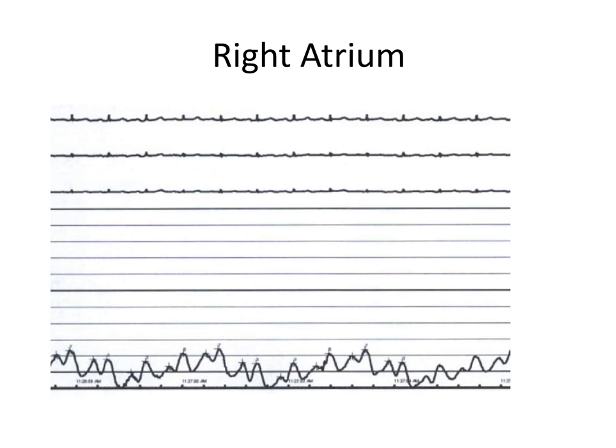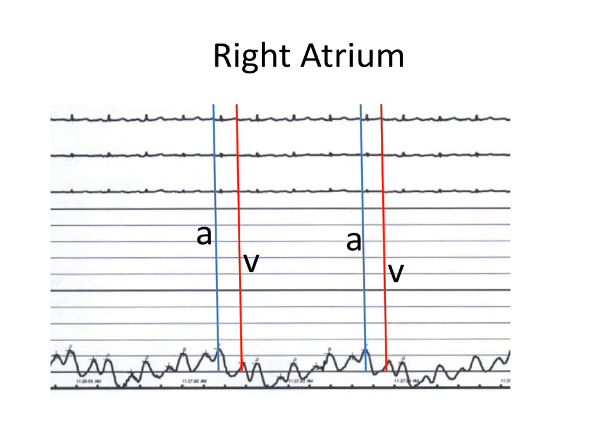Here is a right atrial pressure waveform from an actual patient. There are two aspects of this tracing I want to highlight. First, I want you to appreciate the variation in the waveform with inspiration and expiration. Second, I want to use this example to learn to identify the A and V waves. You want to find a waveform that corresponds to end expiration. Find your P wave and T wave on your rhythm strip and draw a line down to identify your A wave and V wave. The blue line at the P wave identifies the A wave; the red line corresponds to the T wave and identifies the V wave. The A wave pressure is what you will use as your right atrial pressure. When finding end expiratory pressures, you want to identify the waves that are at the peaks.